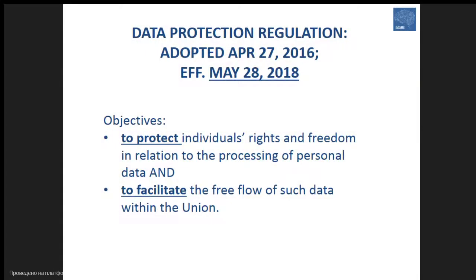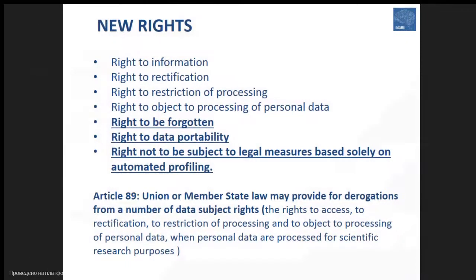In Europe, from the 28th of May 2018, there is a new data protection regulation which has recently been adopted, and the security issue and concern is addressed on the highest level of EU regulation. The objective of this regulation is to protect individual rights and freedom in relation to the processing of personal data, including, of course, medical data, and also to facilitate the free flow of such data within the Union.